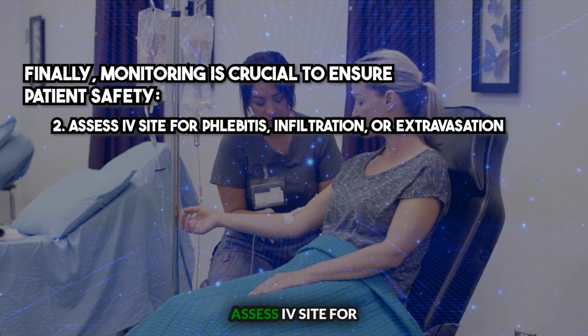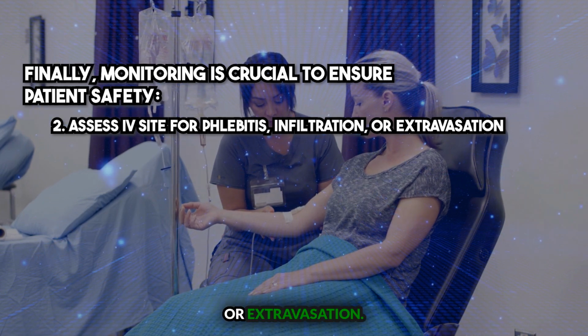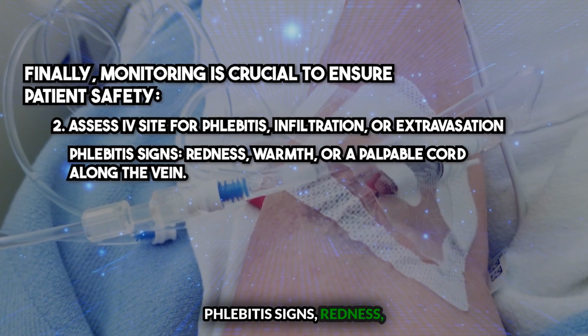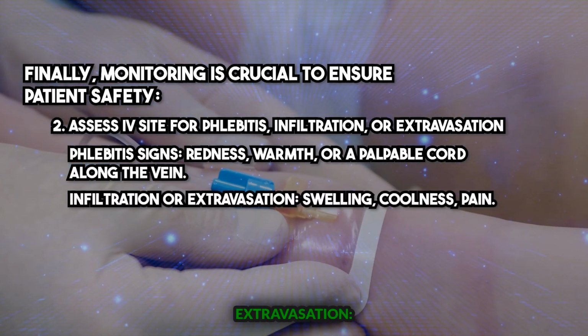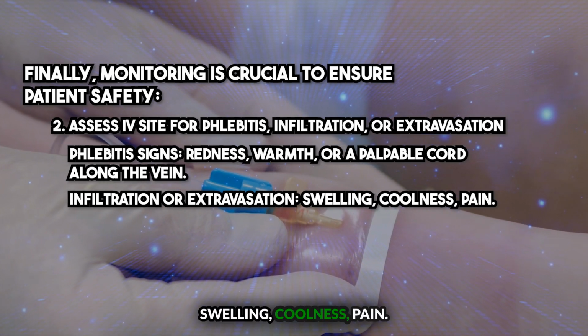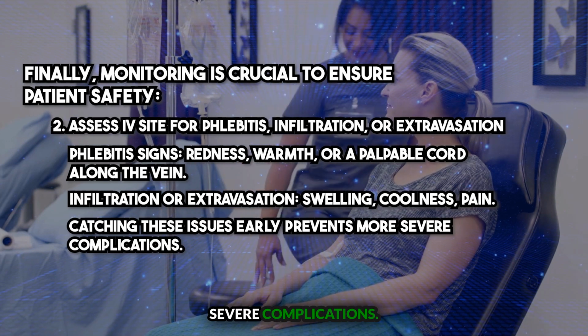2. Assess IV site for phlebitis, infiltration, or extravasation. Phlebitis signs: redness, warmth, or palpable cord along the vein. Infiltration or extravasation: swelling, coolness, pain. Catching these issues early prevents more severe complications.